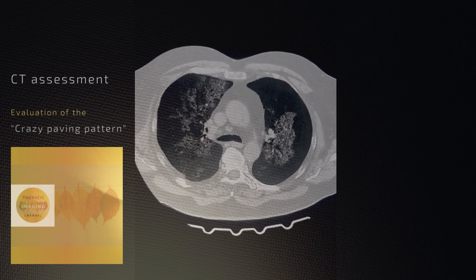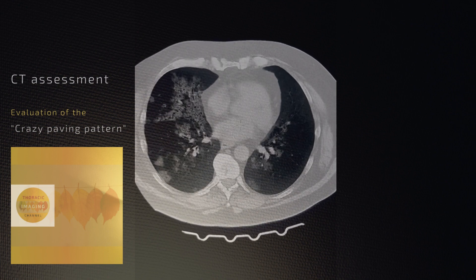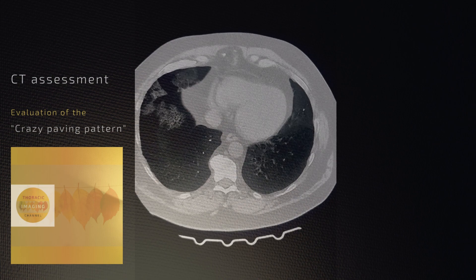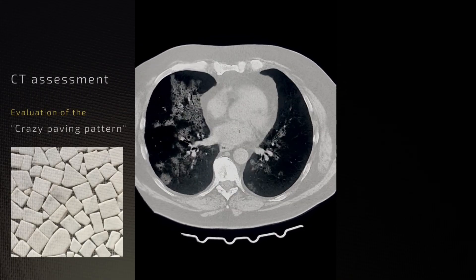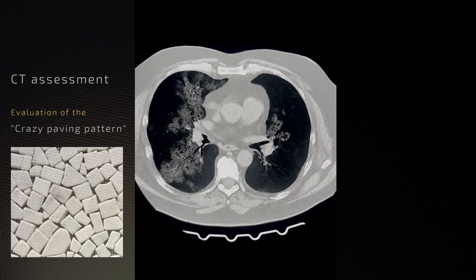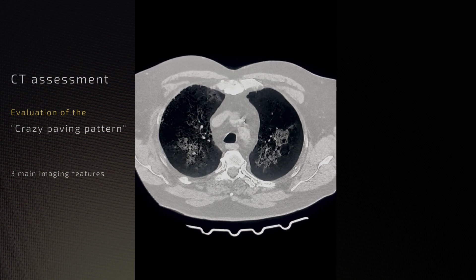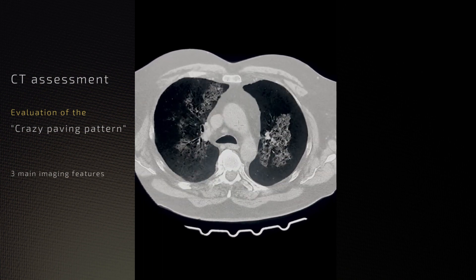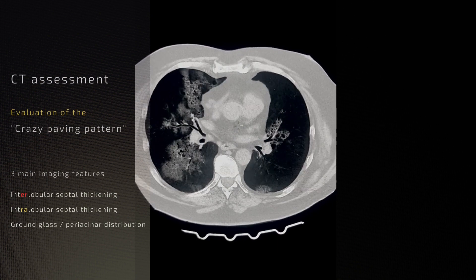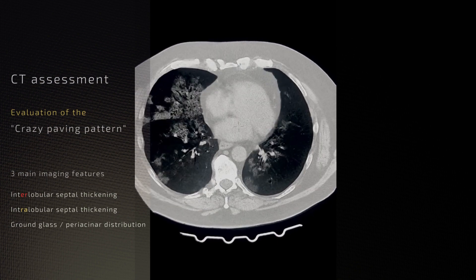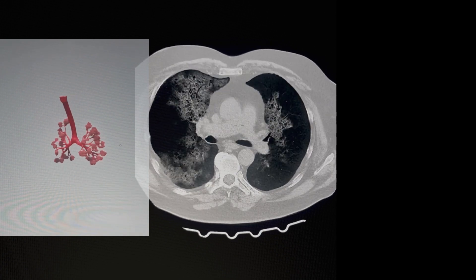In this video we're going to analyze a classically described CT pattern traditionally known as the crazy paving pattern. For this pattern there are three specific distinct features that should be present, as shown on this CT scan. We will need to understand the anatomy of the lung to further understand this pattern.